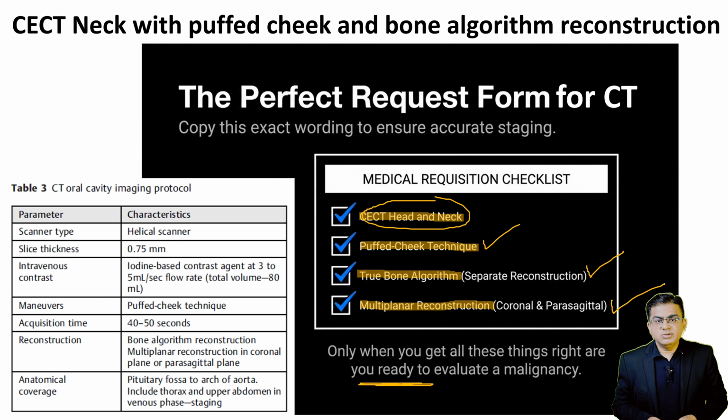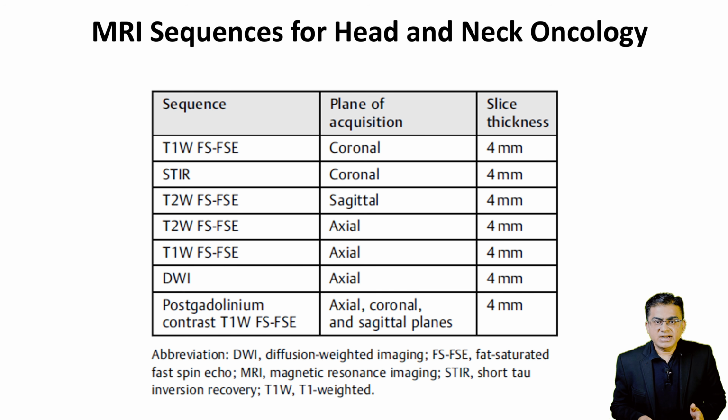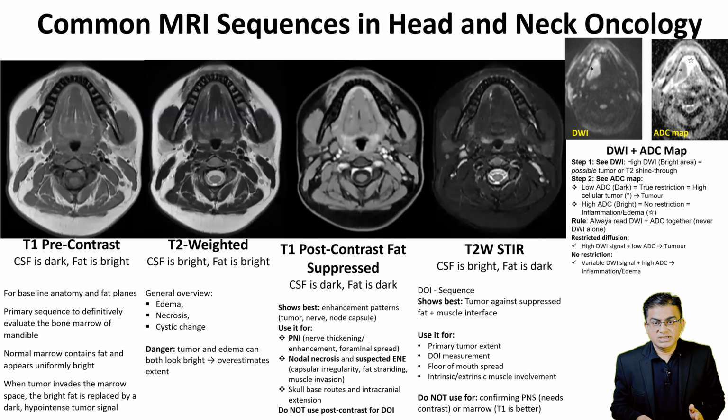Let us talk about another modality, MRI scan. These are the necessary MRI sequences we must acquire for any case of oral cancer or head and neck cancer. This slide is going to be very heavy for you. There is a lot of information in it. I can't tell you how important it is for you, and I'm going to spend a lot of time explaining this slide. It is my request to you that you watch this slide only if you are in a good mood to grasp. Otherwise, skip five minutes of video and continue watching. Let's start.